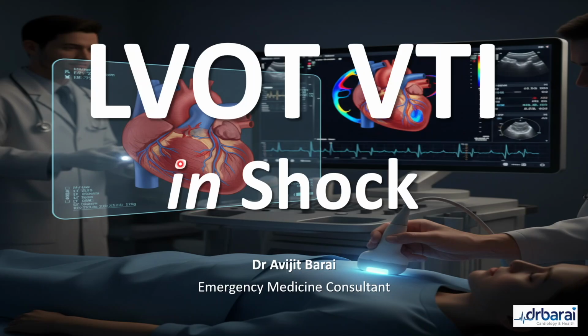Shock is a very common presentation in the emergency department and intensive care unit. We see this type of patients all the time, whether it is a septic shock, anaphylactic shock, hypovolemic shock, traumatic hemorrhagic shock, or a cardiac tamponade. It's not uncommon. We need to have a very good systematic approach in the assessment and management of this type of patients. That is exactly what we are going to do over the next 30 minutes.